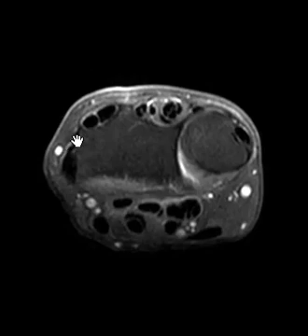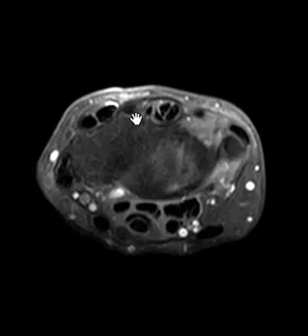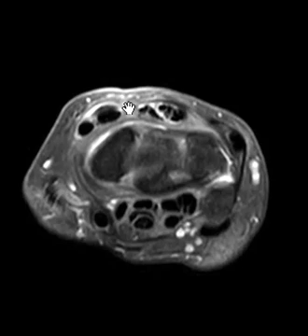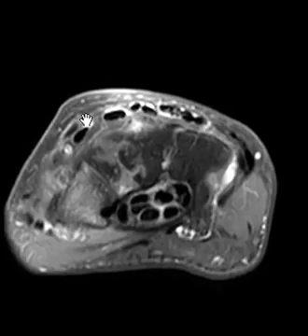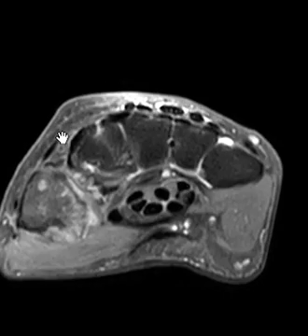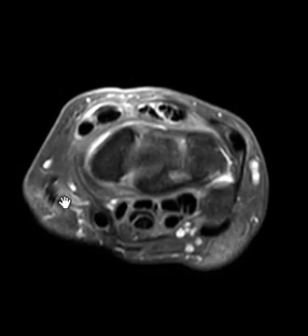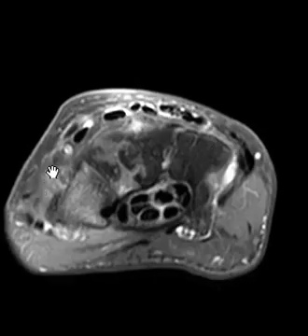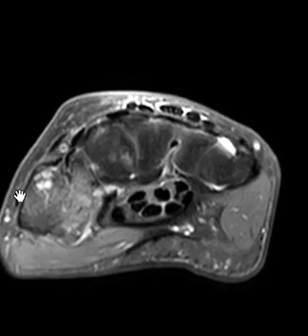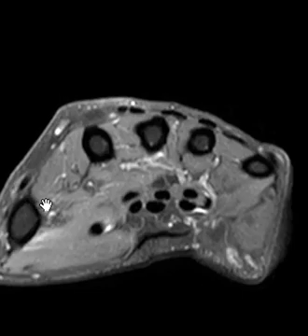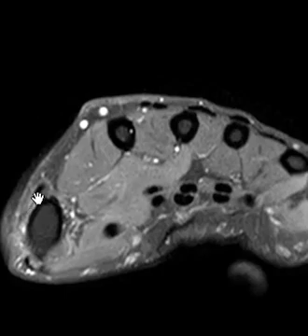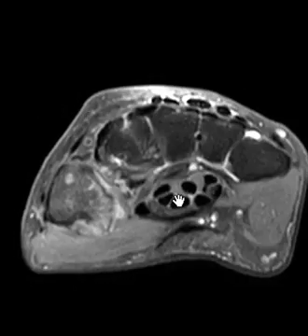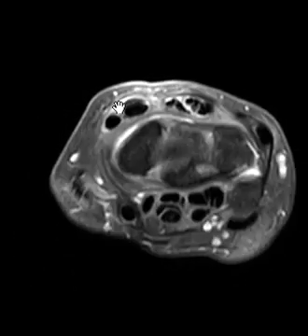So this has to be the extensor pollicis longus and this has to be the extensor pollicis brevis. Let's follow those across — here's the muscle-tendon junction, and there's the tendon going sideways over the top. That's the extensor pollicis longus coming over here. Now if we look over here, here's the brevis right there — that little one. They're going to converge, getting closer and closer as we scoot them over toward the thumb.